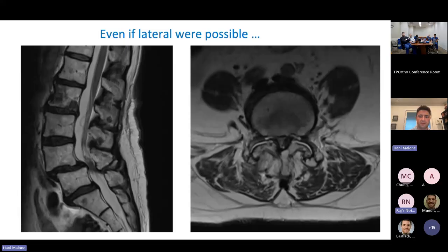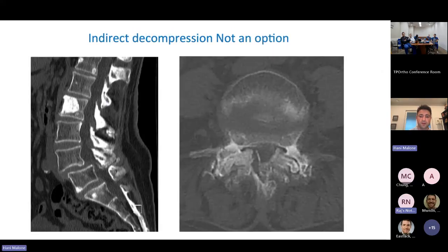So obviously another case where a lateral approach would be difficult given the patient's psoas anatomy and need for direct decompression. And you can see there, sometimes the compression can just be horrific with a slip and arthritic changes to the facet joints. And so getting a tube down there, being able to drill it all off really does at least prove to yourself that you're doing a good job with the decompression.